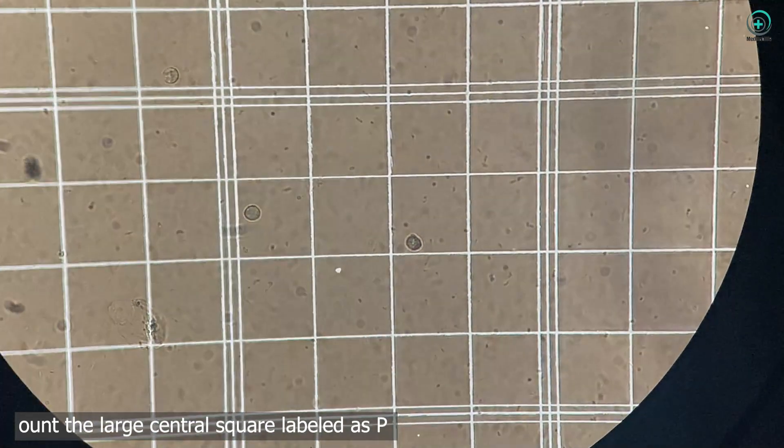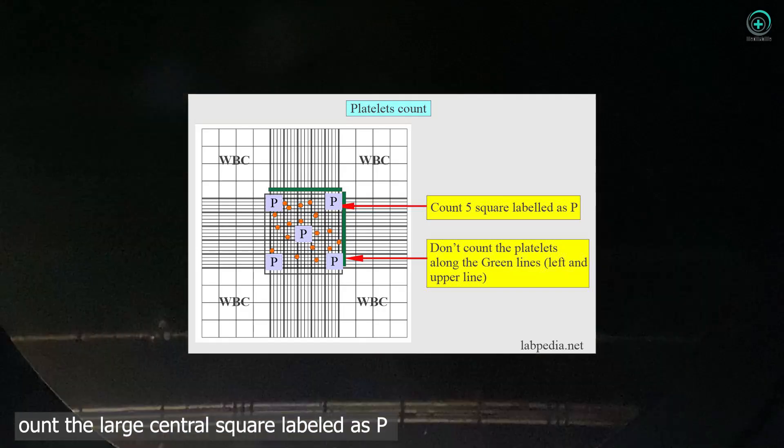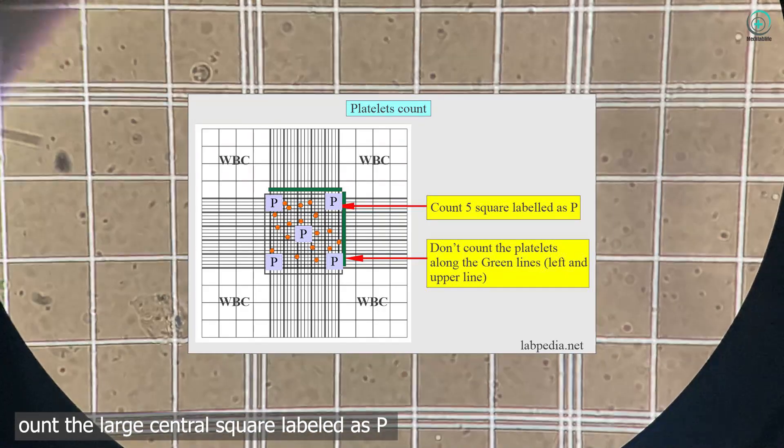Step 7: Calculating the platelet count. Now for the math. We count the platelets in that central square and use the formula to calculate the platelet count per microliter.